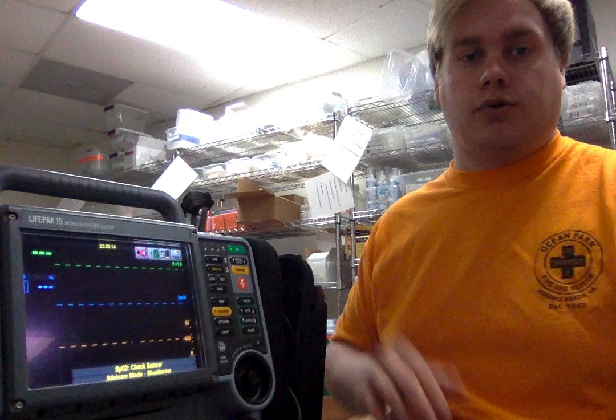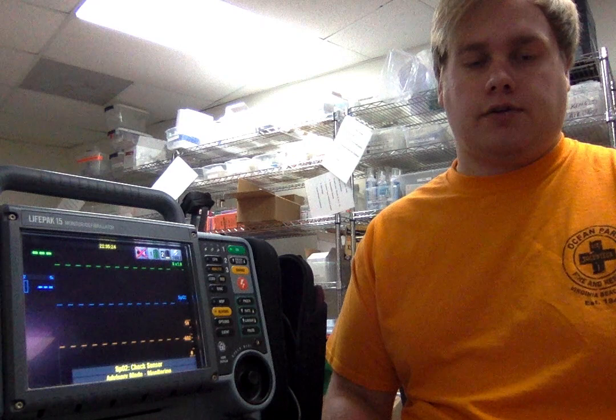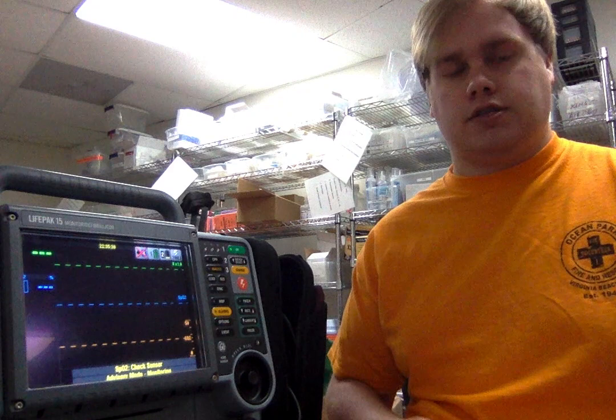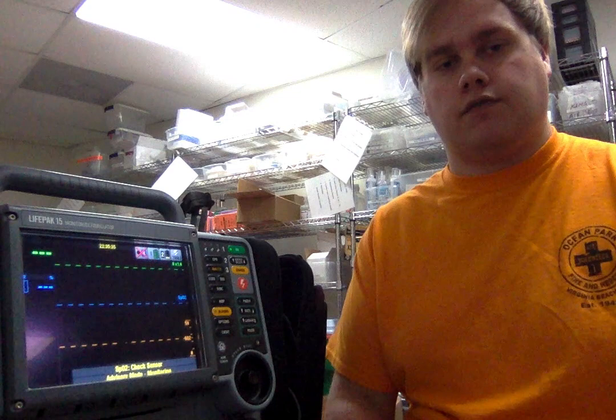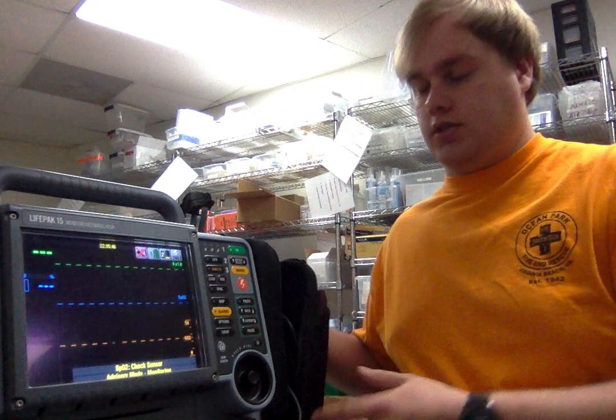From there, you can also put it in manual defibrillation mode. This would allow you to choose your dosage at 300 joules, 200 joules, or 360 joules. You can defibrillate your patient at those settings. You can also pace your patient. You can use these pads for defibrillation or pacing, as well as it has an option for synchronized cardioversion. All of which can be controlled by this side of your LifePak.